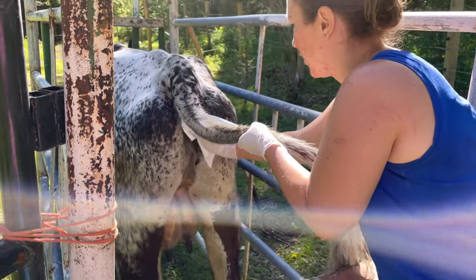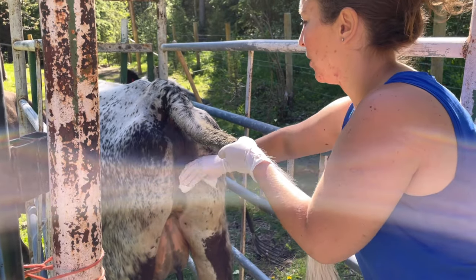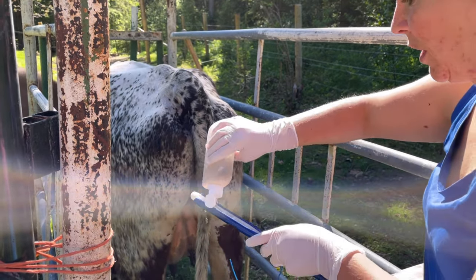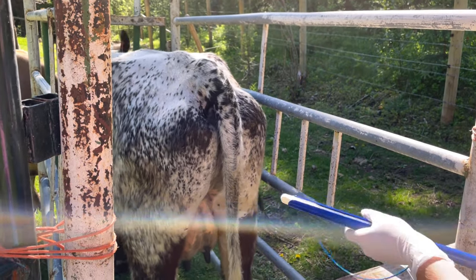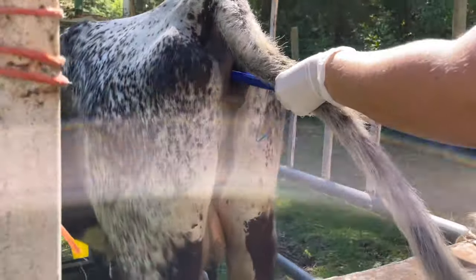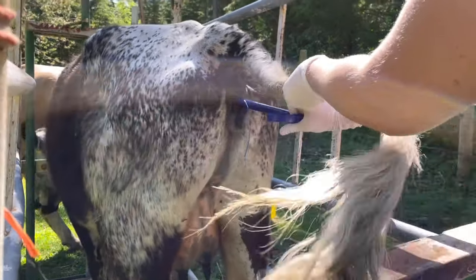What you want to do is make sure that their vulva area is clean of any stool, because you obviously don't want that getting into their reproductive tract. And then we're going to lubricate our CIDR applicator device.